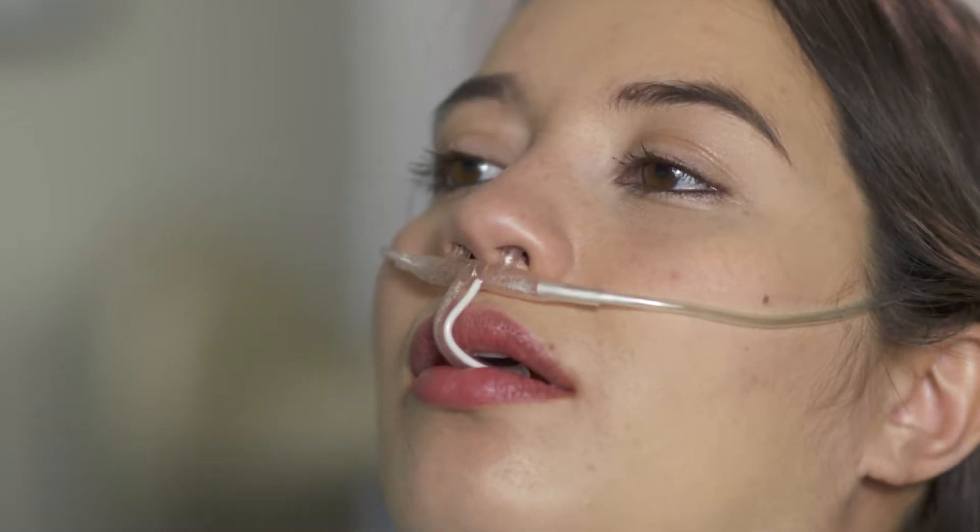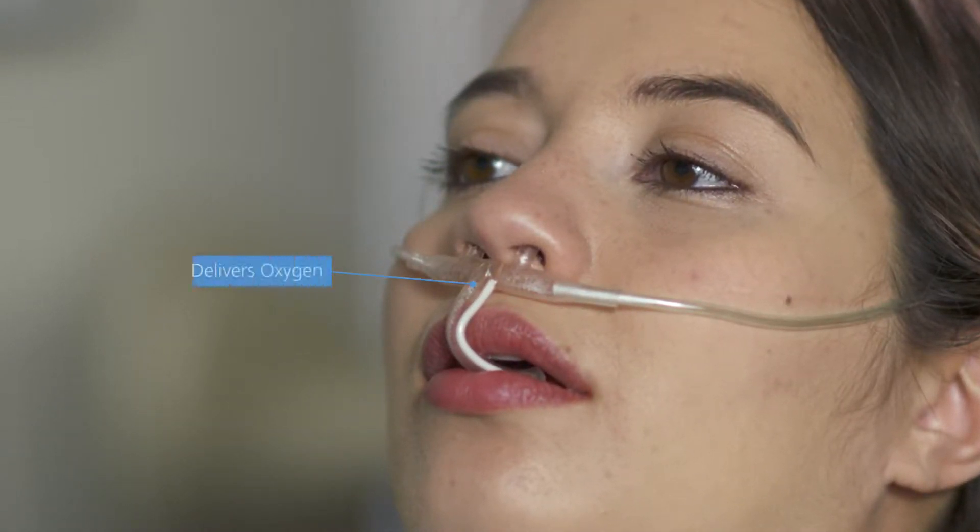An oral-nasal cannula has a small sampling tube near the patient's mouth to capture the exhaled air. This type of cannula is divided with two sampling lines: one to deliver oxygen and the other to sample CO2.